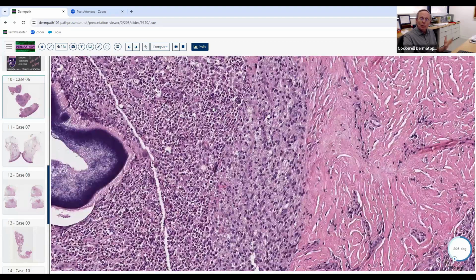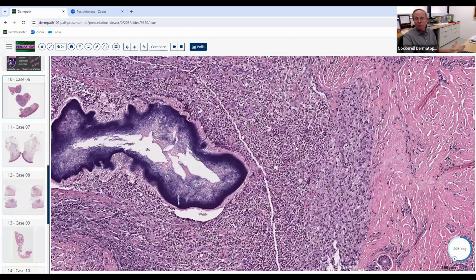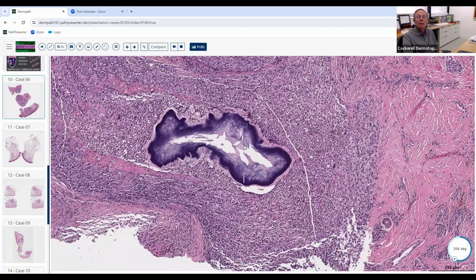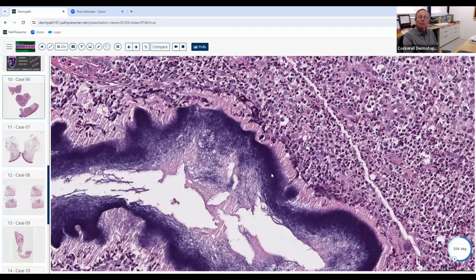And you say, well, suppurative granulomatous inflammation, what are the things that cause that? Where do you see suppurative granulomatous? Like infections. Yeah, infections are one very common setting. Ruptured folliculitis, ruptured cyst, hidradenitis suppurativa, actinomycetoma, all those things, acne, all of those. And then other things like this thing.